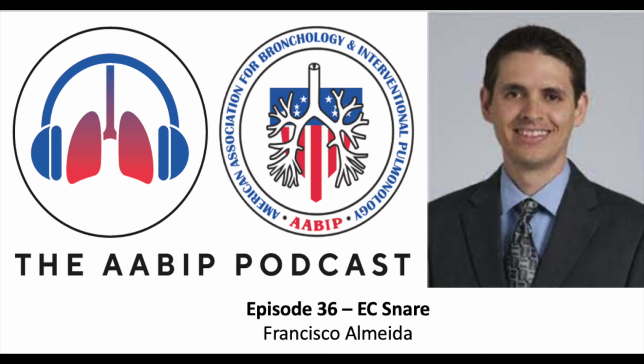So one thing that I like to use often is a cryoprobe. Just put the cryoprobe on it and freeze it. I think that's the most guaranteed to come out and not be dislodged, assuming that it fits into the airway that you have available, either the rigid or the ET tube. And sometimes I have actually used the snare itself. I use the snare to grab the lesion, and without using energy, just put enough pressure to hold it and bring it back. So I try not to put another tool on the table.